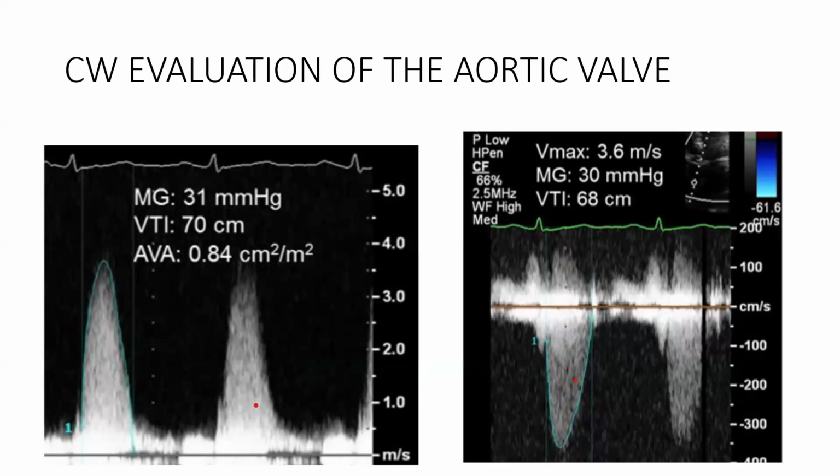I think the next step for her would be to do a stress echo. I think I've seen this somewhere in one of those books, and at the end it was a stress echo. I can't really remember, but I think it's because of the low gradient AS, so that you can differentiate if she really has an AS or not.